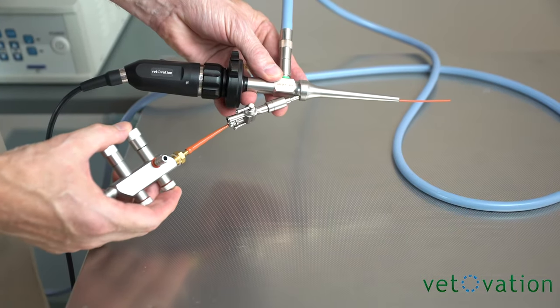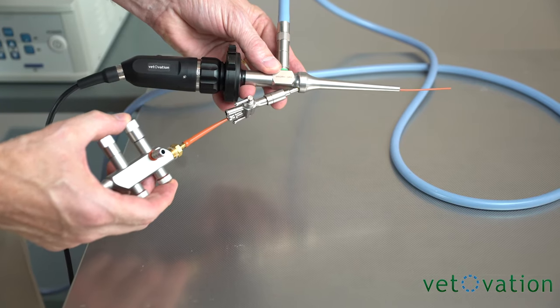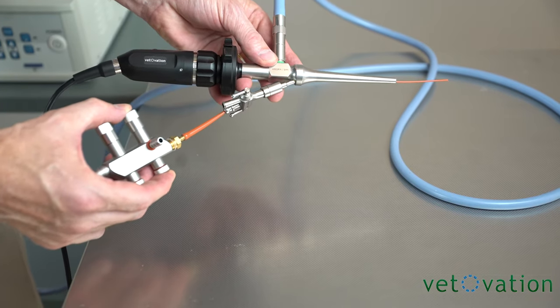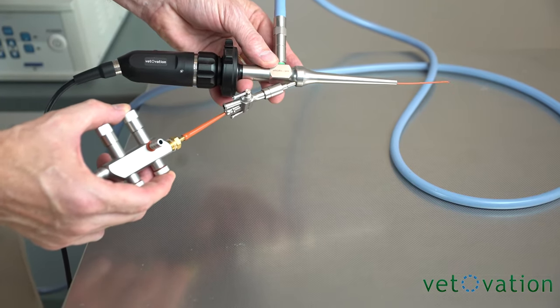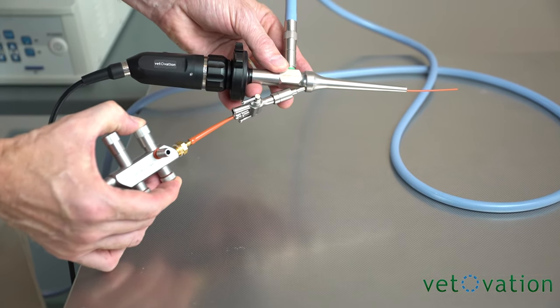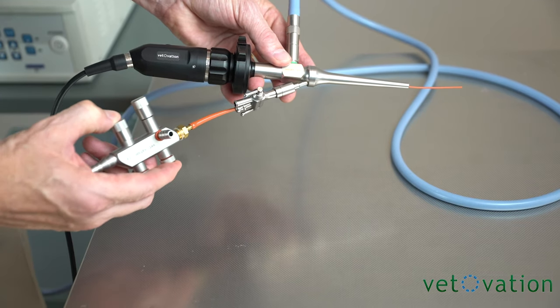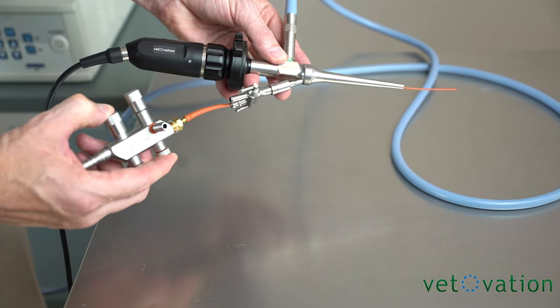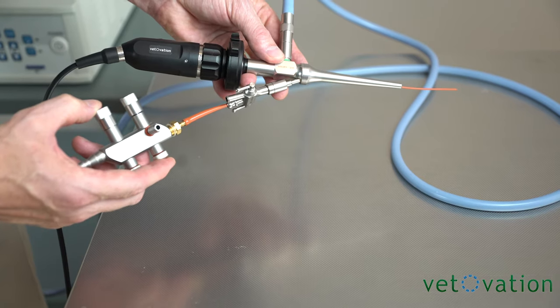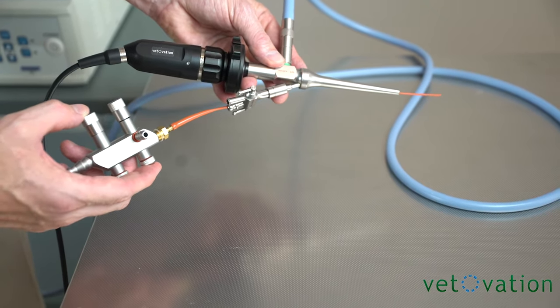Enabling suction and irrigation during video otoscopy is very beneficial. So with this suction irrigation handle, you can attach it to an IV bag with a pressure cuff and then your floor suction canister. Depressing this button will give you irrigation into the patient. Depressing this button will suck that fluid back out. Most people use a standard five French red rubber catheter to introduce this down the lumen of your scope.